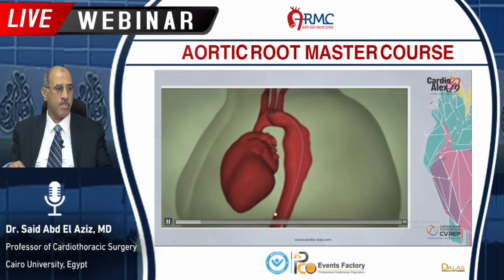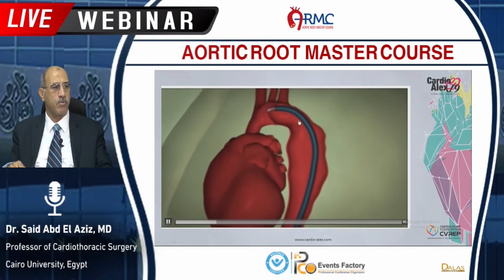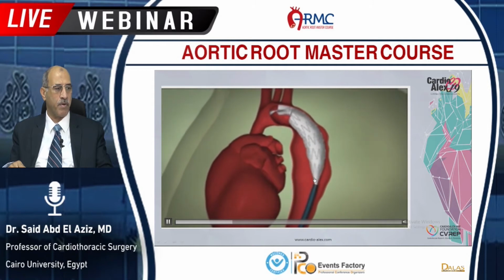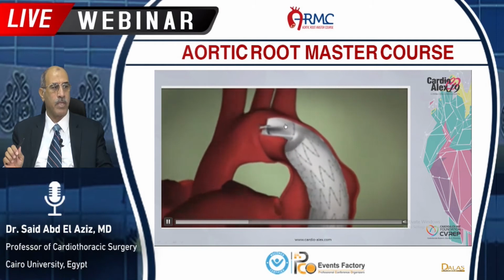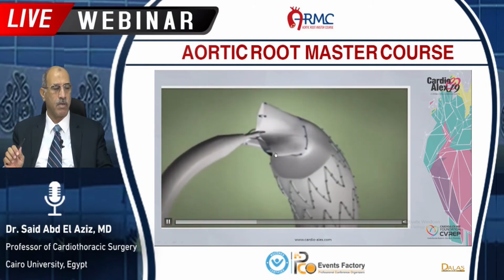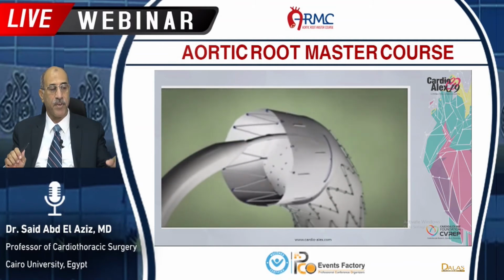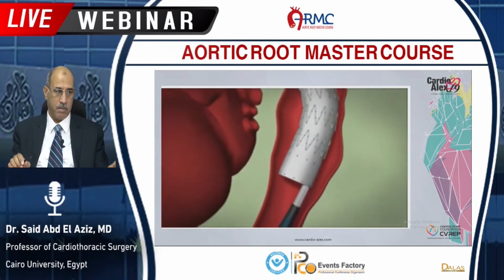First, we introduce the wire like here. Then above the wire, we introduce the stent. Then we just give the stent away from the sheath. This is not yet deployed. And then we deploy the first stent, which we call release the capture. After releasing the capture, that means the stent is fully deployed.